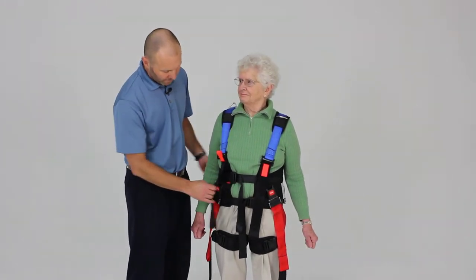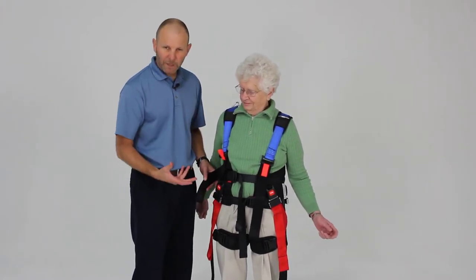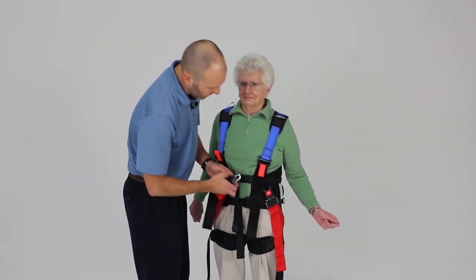On alternative positioning for the straps, this is the gluteal fold strap that comes up to the front part of the belt. For certain patients, if you want to give them a little more support, we've found that criss-crossing these can be an effective way to capture the pelvic region.